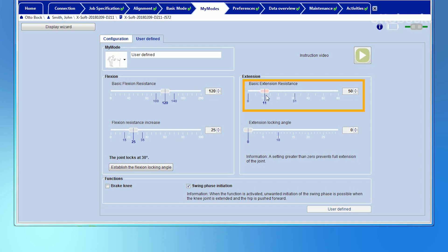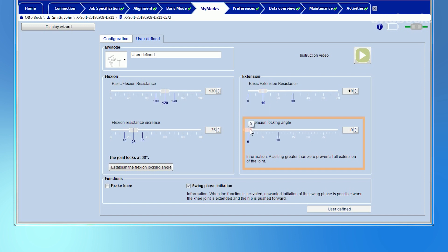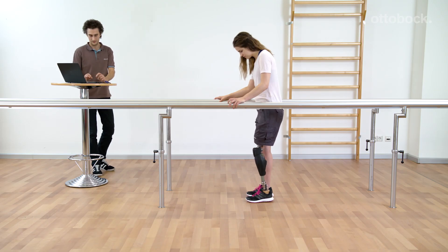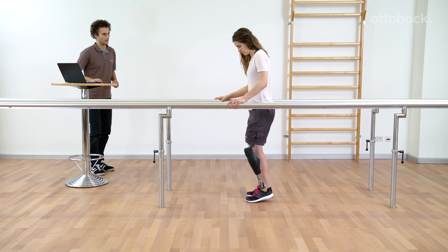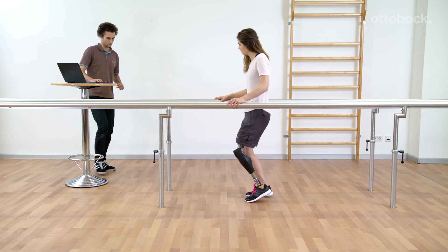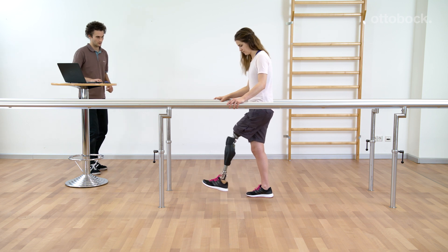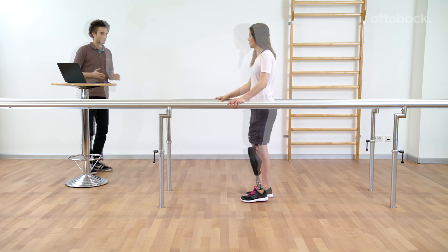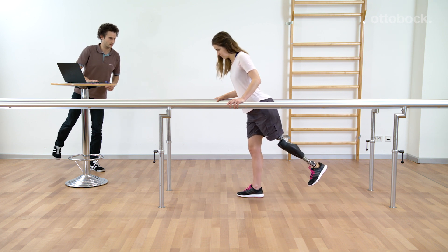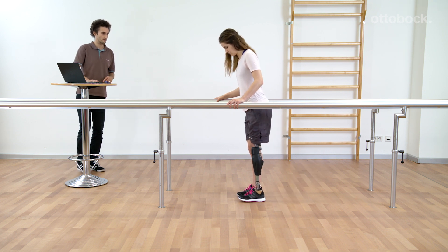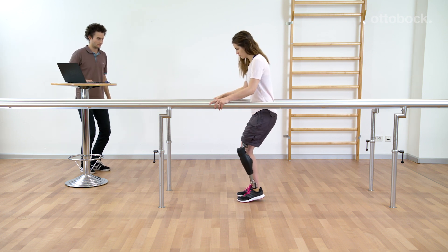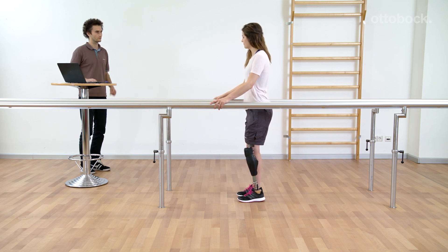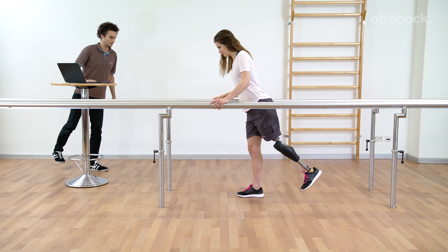In this example, basic extension resistance is relatively low and the extension locking angle is set to 25 degrees. If there is no lock during the flexion movement, the user can bend the knee through the full range of motion. However, the extension movement stops at an angle of 25 degrees. To extend the knee joint, the user needs to hold the prosthesis back and in the air for roughly 2 seconds. The knee joint will move into full extension. Now the user can stand upright, but the My Mode is still activated. When the user bends the knee joint again, it will restrict the extension again at 25 degrees.